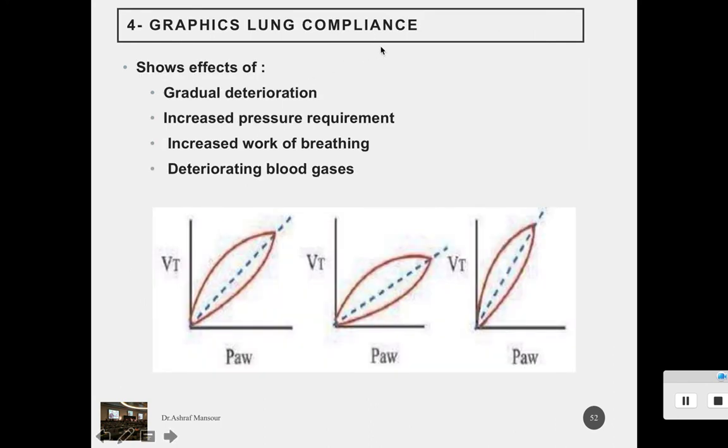This is again the compliance curve and what it shows. If we consider this is the normal, for example, what does a shift of the compliance to the right mean? What does a shift to the left mean? Here, if we are looking at the trend of the compliance, this is very important. It will tell you that after a few hours there is more shift to the right, which means that the compliance becomes bad. So you have to search why.